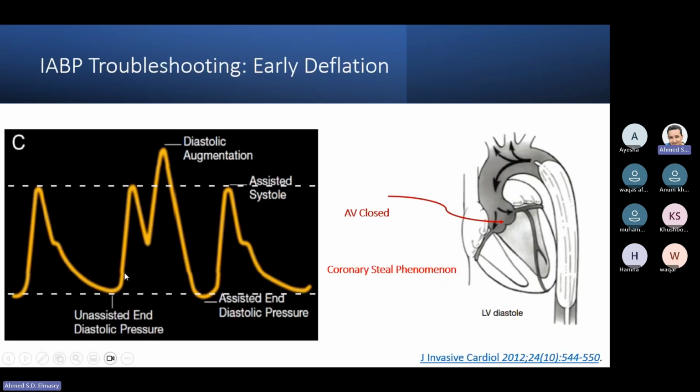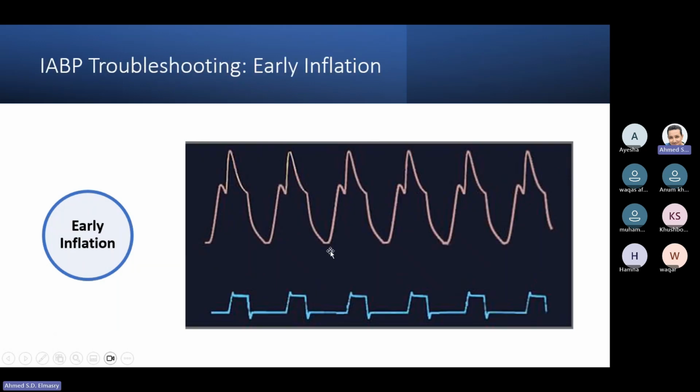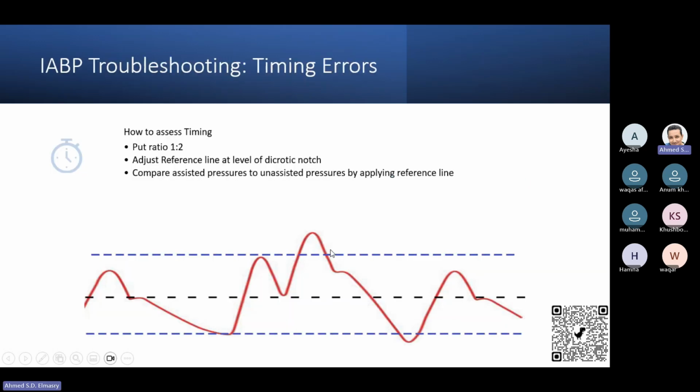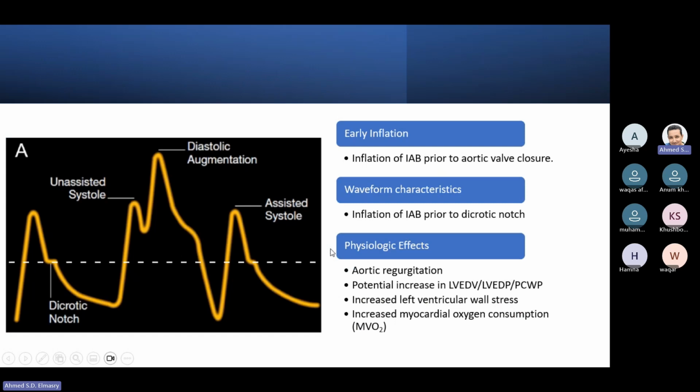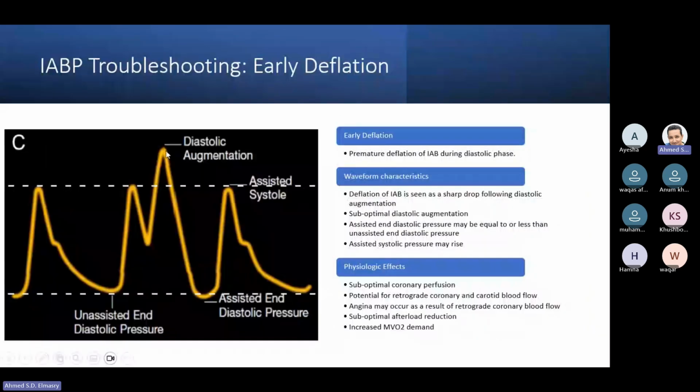And also, if you compare the early deflation to the normal waveform, you will find that instead of going like this, the deflation happened very early.